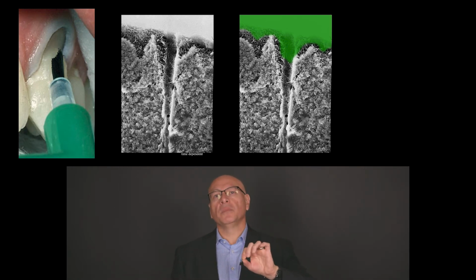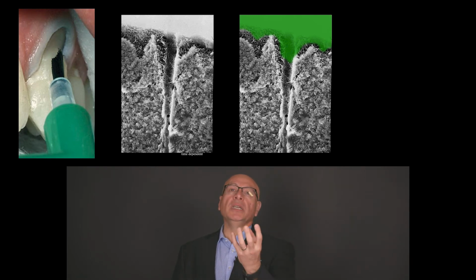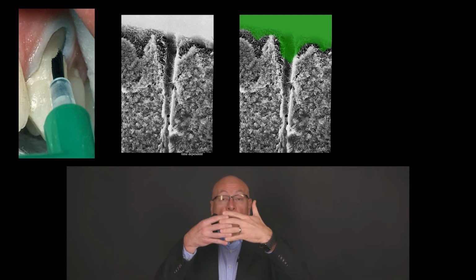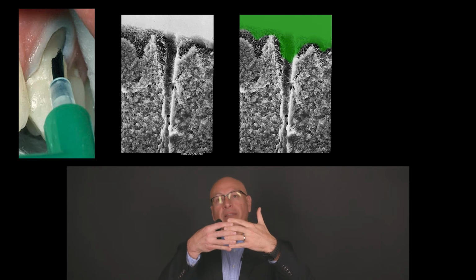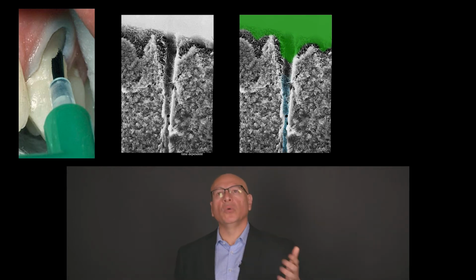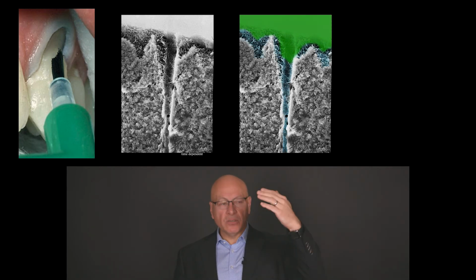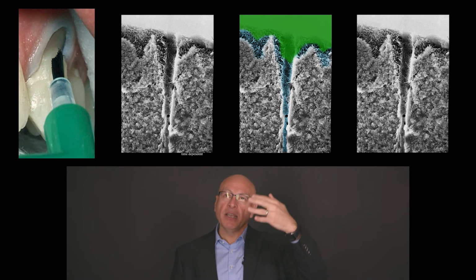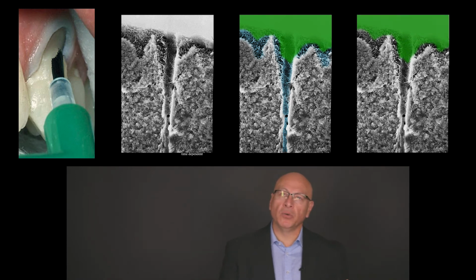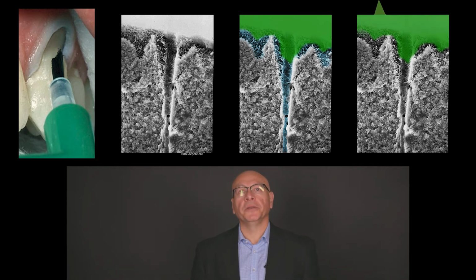If you do not infiltrate that resin back, the water coming from the dentinal tubules is going to occupy the space that should be occupied by resin. And all of a sudden, you don't have a good replacement of what you removed, and then you get postoperative sensitivity and weak bonding. So that's not what you want. You want to apply your primer in multiple coats, to allow this resin to really infiltrate and fill all those spaces, like you can see in the animation on the right side, filling completely in.